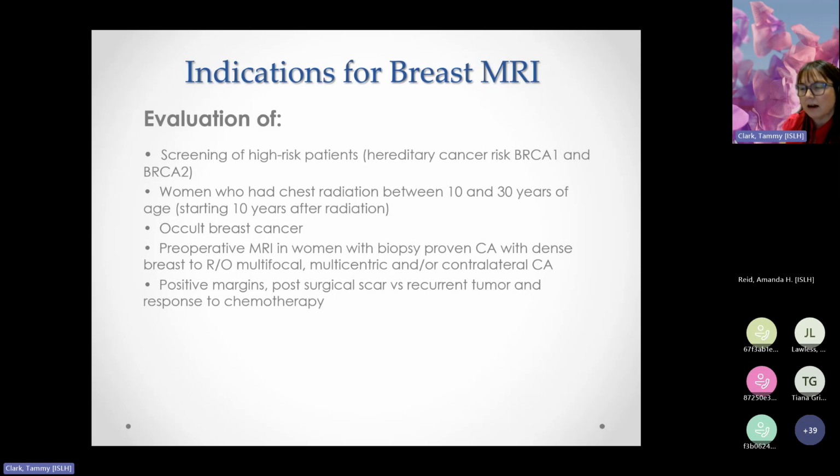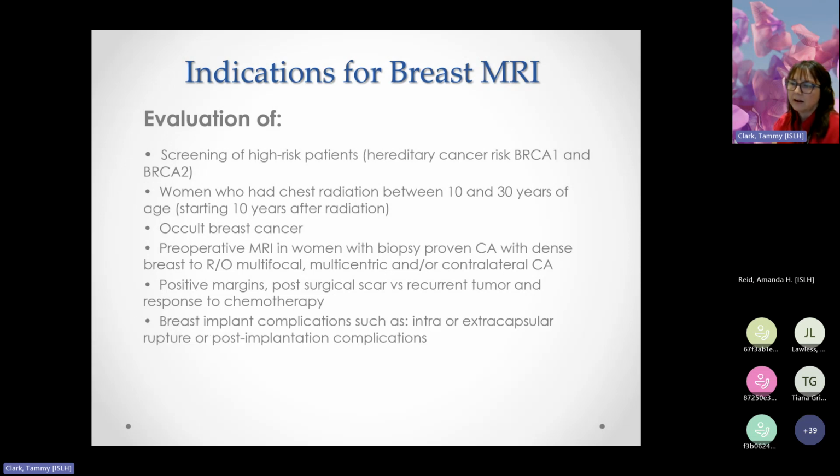So we're putting a little tiny tissue marker in the main lesion before they start neoadjuvant, and then they're giving this chemotherapy in hopes of shrinking the tumor so that they can get better margins when they do take the cancer out. So you may be asked to monitor this patient with ultrasound. Quite often they're doing it with MRI, so you may see a lot of neoadjuvant patients coming back to monitor how the lesion is shrinking.